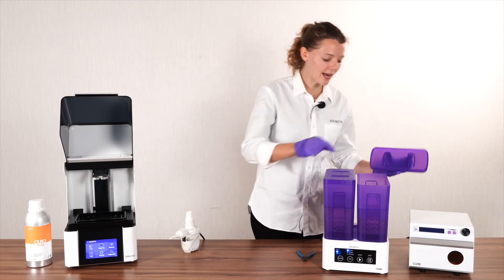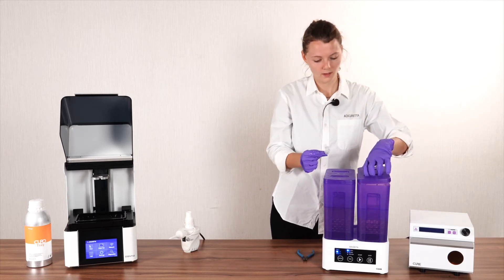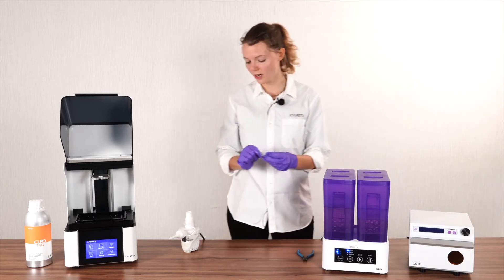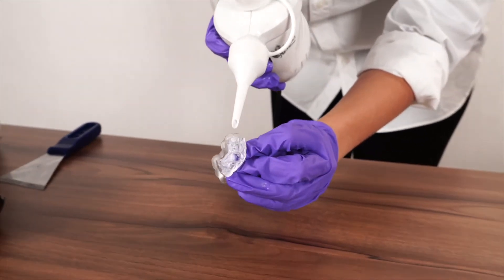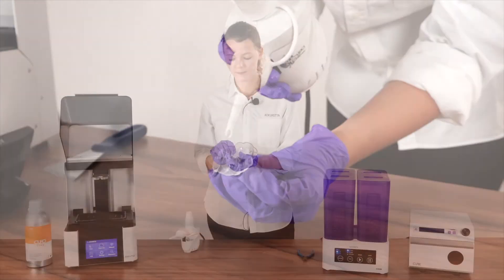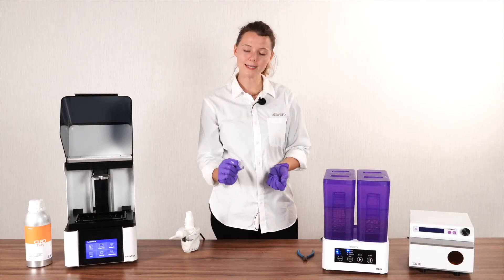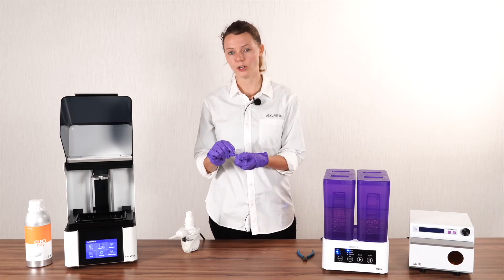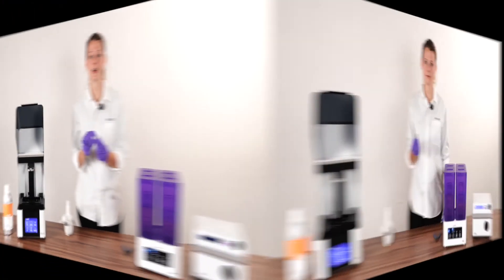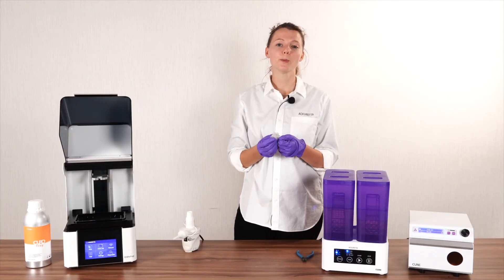Now that our second wash cycle is finished, we're going to take out our print and dry it. We do that because we want to make sure that once we place it in our curing oven, there is no discoloration. Really make sure that your print is dry.